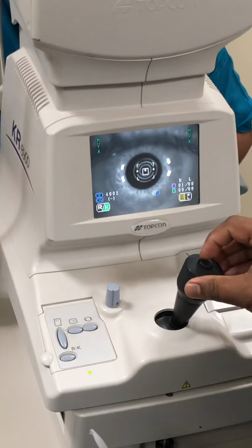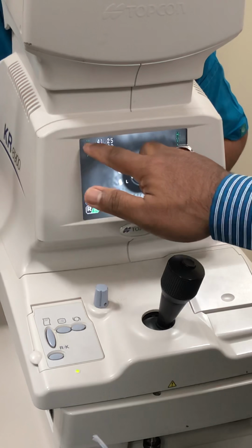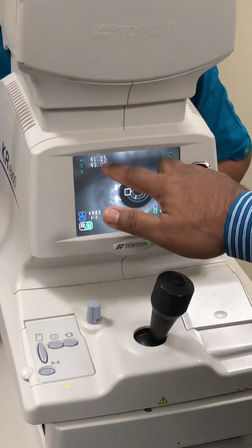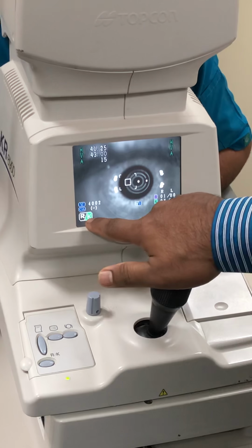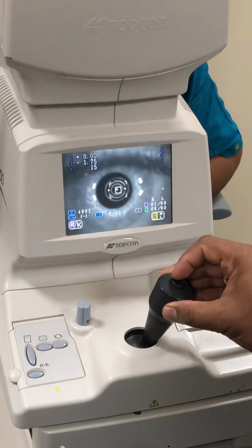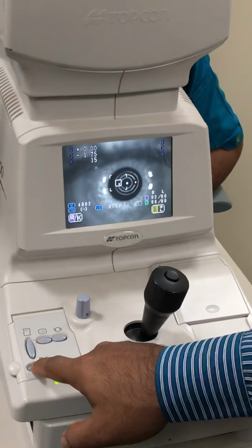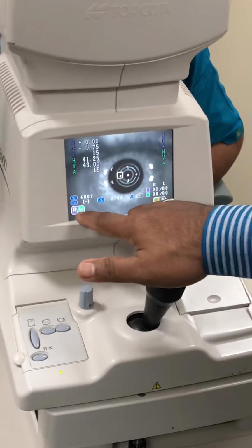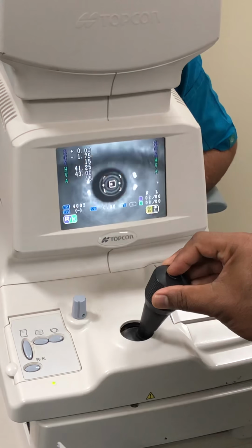See, this is keratometry here. Can you see 41 and 43? Horizontal 41.25, vertical is 43, and the axis is 15. So you select here, can you see it is selected keratometry here. And if you select R, it is only refraction. It will only show you the refraction here. And if you select both, now both are selected. That means it will give you both the values. This is refractokeratometry, both.